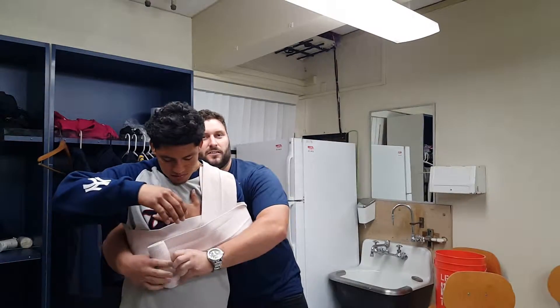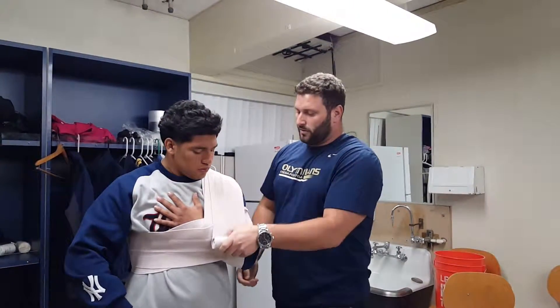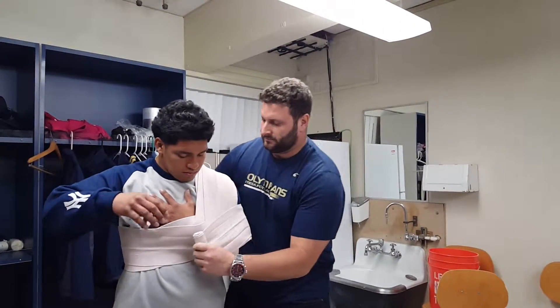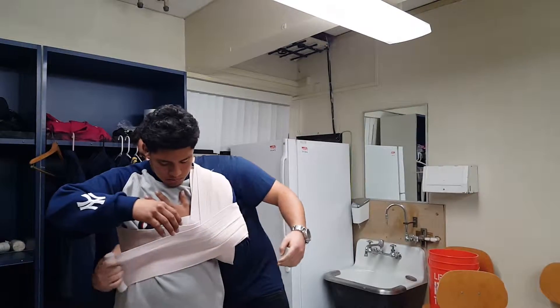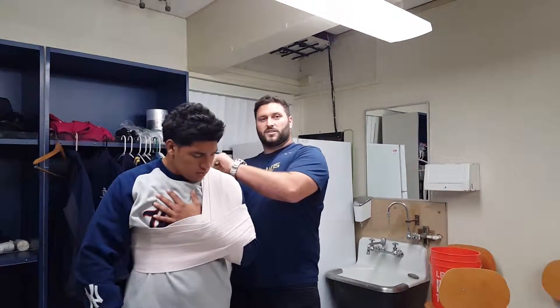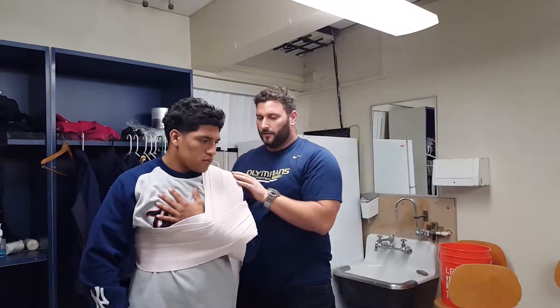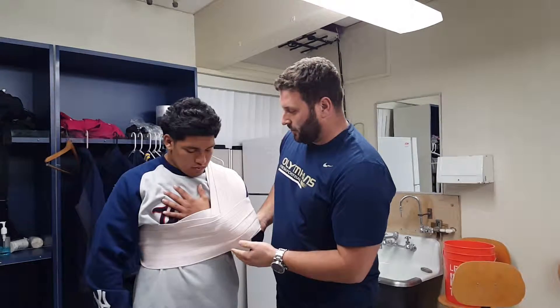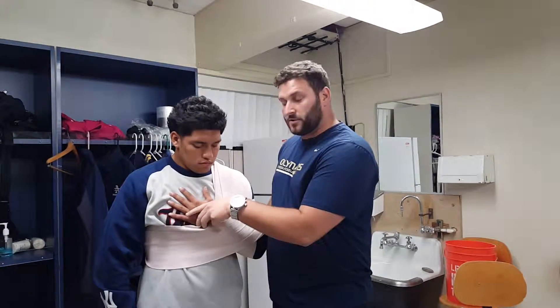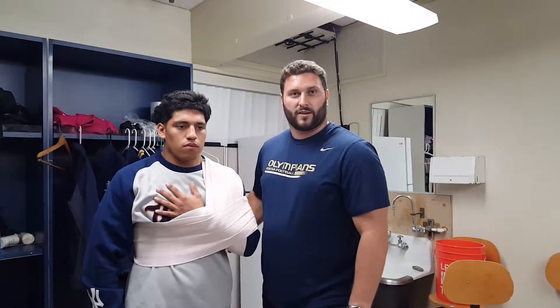We'll do this until the joint is secure. Once it's secure, you'll tuck in the remainder. You'll want to make sure that the joint is immobilized, and that there's room to check the radial pulse, as well as room for ice to be applied for the injury.